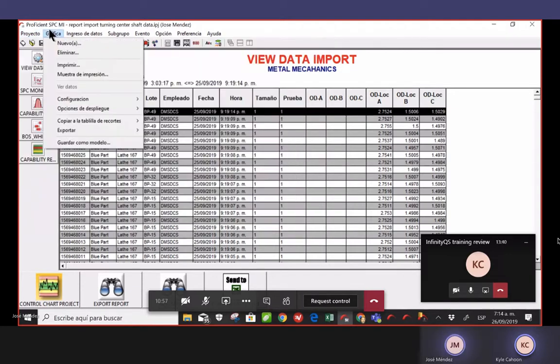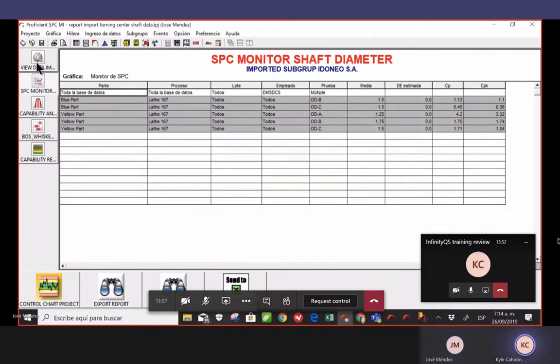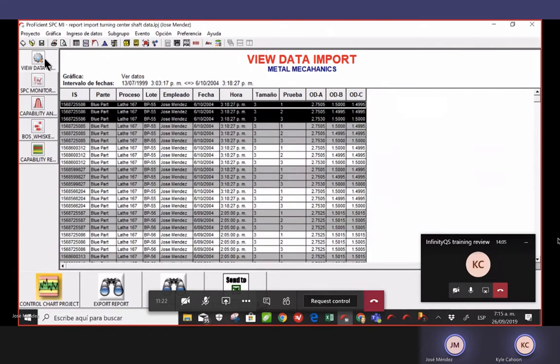If you go to the graph configuration option, actually, the easiest way is just to press, if you switch from one to another, that should do it. No, it's still there. Press F5 on the keyboard. Okay, there we are. So all of the data's been deleted.